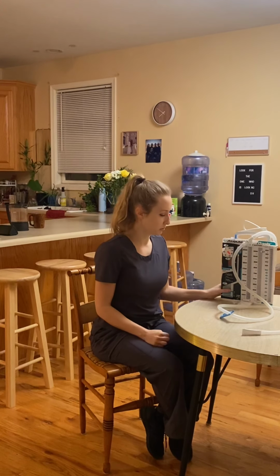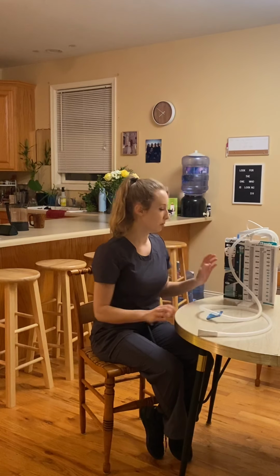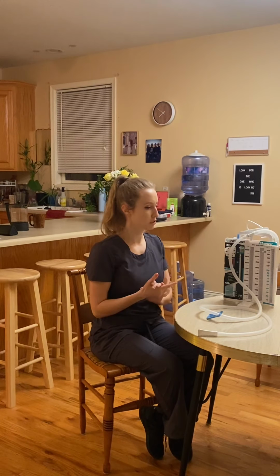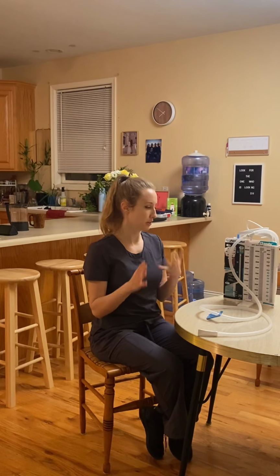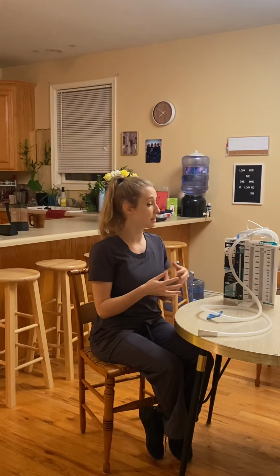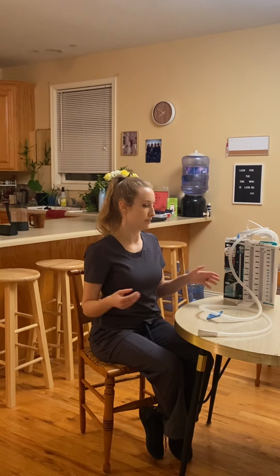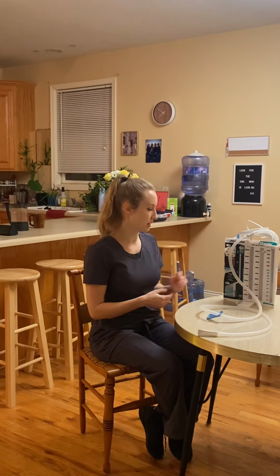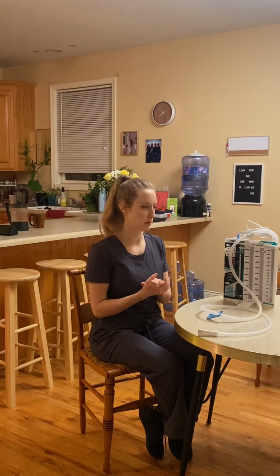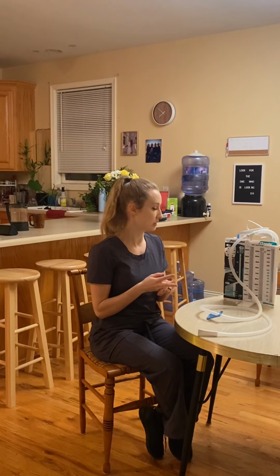So we have your chest tube here, and this part would be in my patient. You'll notice, Mr. Smith, that it does have a few sutures holding that in place. You should have this chest tube for about 2 to 3 days. Not everyone is the same. It will be up to your surgeon to decide when to remove that. It'll be based on the x-ray to see whether your pleural space no longer has that infection in it. We decided that you were a candidate for this chest tube based on an assessment of your respiratory health, your age and overall health, your cognitive level, and our x-ray and CT findings.